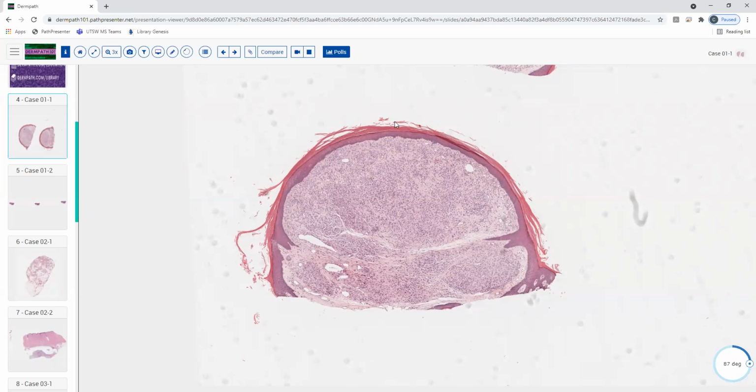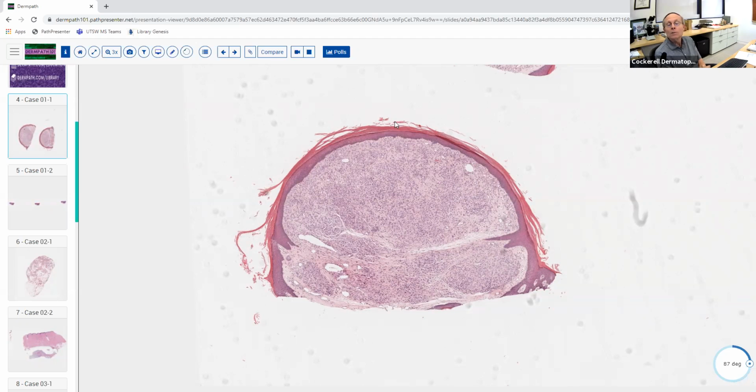Symmetric, circumscribed. I'm drawing a blank on the last one. Small, relatively small. Oh, small, yes. Small, symmetrical, well circumscribed, the 3 S's, if you will. So you draw a line right down the middle of this. You can fold this side over on that side. It looks pretty much the same.